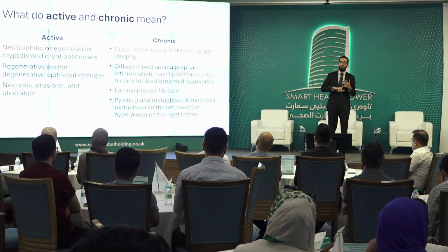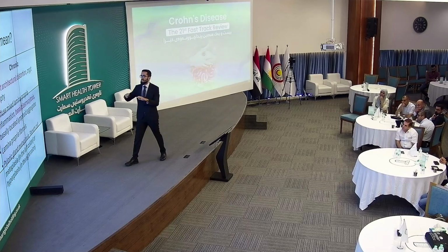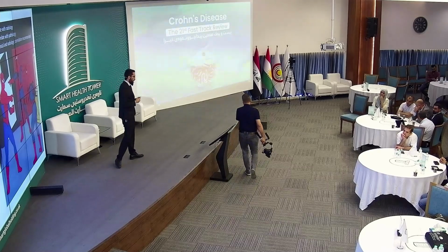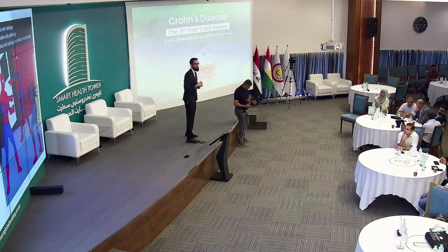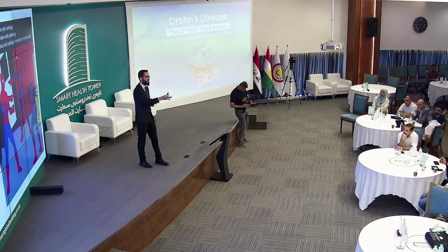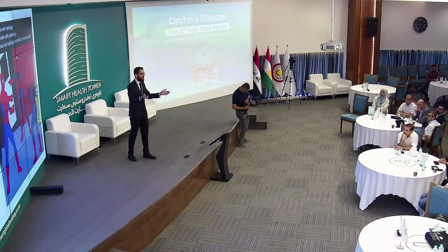No, we refer to glandular architectural distortion that I showed in the picture, as well as heavy basal inflammation. So in pathology, for most of the conditions, probably more than 90%, we can give a specific, definitive top-line diagnosis. So I can say adenocarcinoma grade 2. I can say it's a leiomyosarcoma or any other of the conditions that we have.